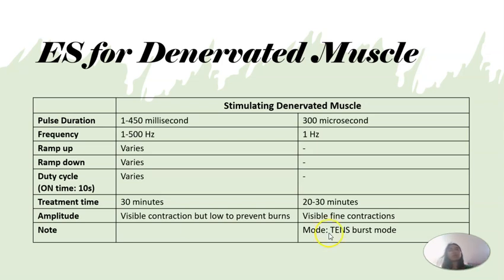That's why you can notice, ang maximum frequency natin is 1 Hertz, yung pinakamababa na Hertz para mas targeted yung muscle talaga itself. So, kaya in your portable ES machine, ang parameter na i-observe natin, yung maximum for both of those. Maximum for the frequency is 1 Hertz and maximum for the pulse duration would be 300 microseconds.